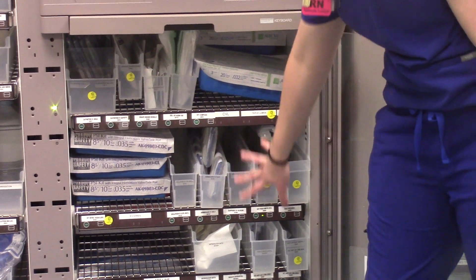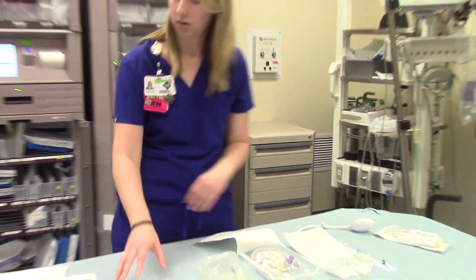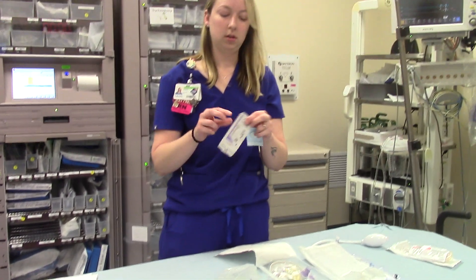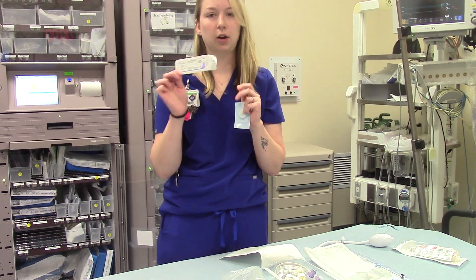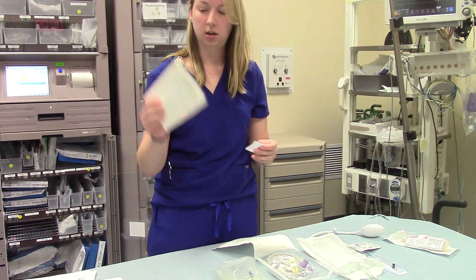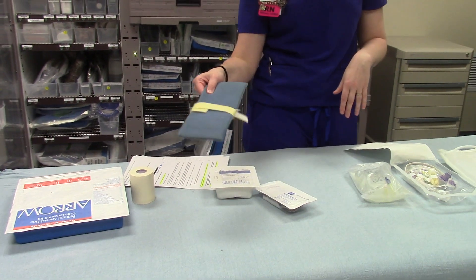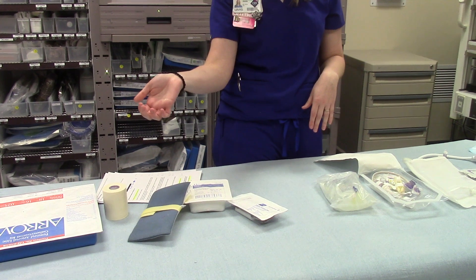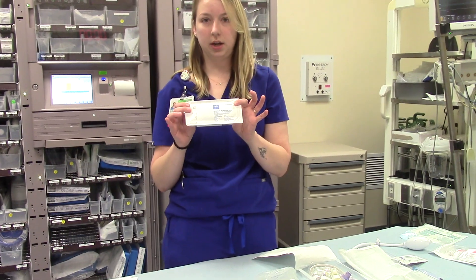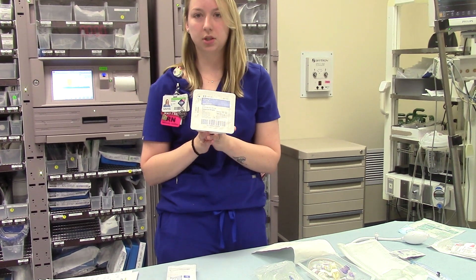This is where all of your art line stuff is going to be. They'll also need a prep to clean with, and then after insertion, a lot of times they'll sew it in — usually using O-silk. You'll also need a bio patch, and a large tegaderm to go over it as well. For radial art lines, they'll usually put a small armboard to help keep everything nice and straight during insertion. To sew it in, you'll need a general purpose suture kit, and I usually grab a couple packs of 4x4s because it can be a little bloody.